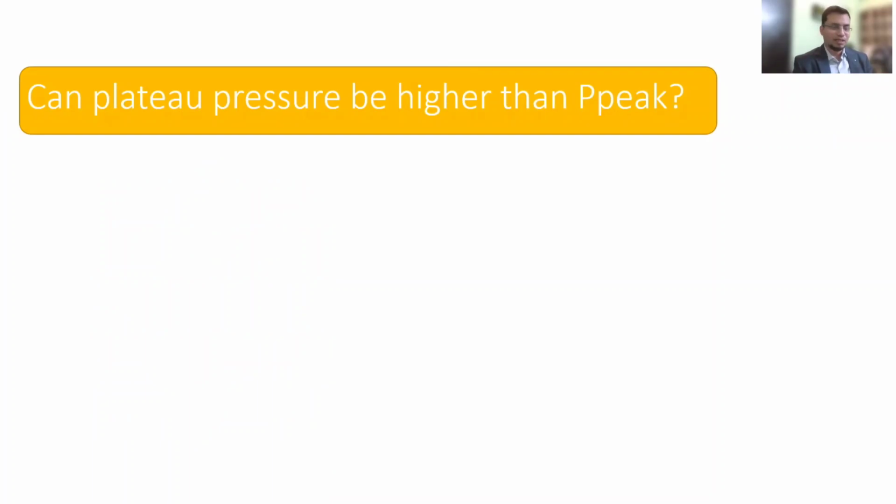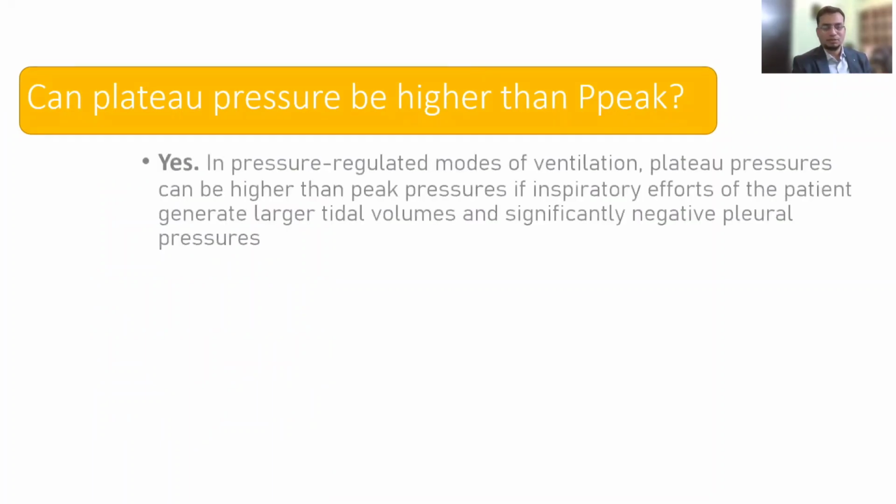Can plateau pressure be higher than peak? So some people might ask you. Yes, there is a scenario. This is the case report.